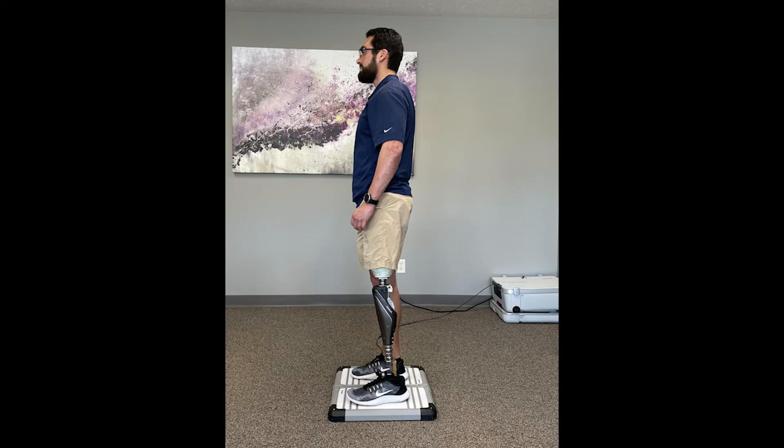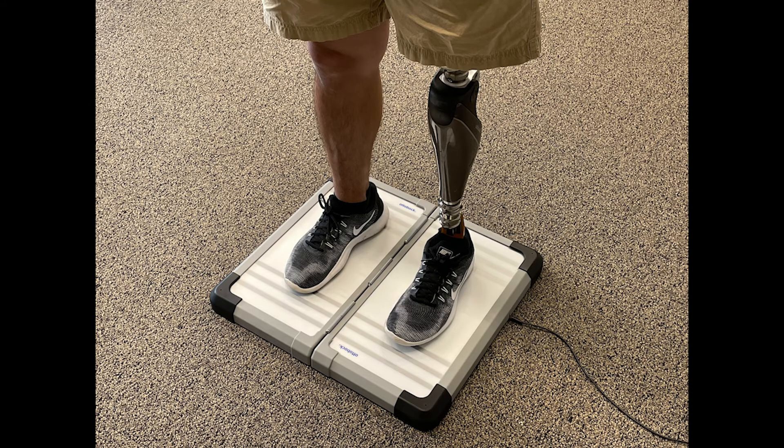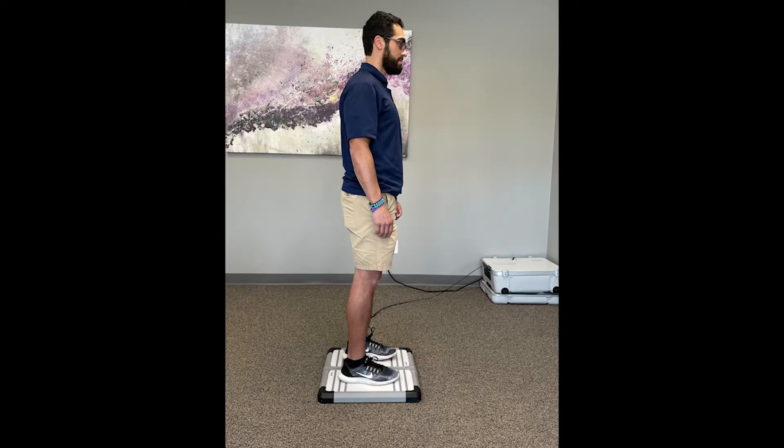Here we can see how a patient is placed in order to utilize the LaserPosture. We ask the patient to step onto the platform and place the toes of each limb on the same line. They will then stand up straight in a relaxed position, let the arms rest by their side, look straight ahead, and try to place equal weight on each limb. For patients who cannot stand unsupported, we utilize a walker for assistance.